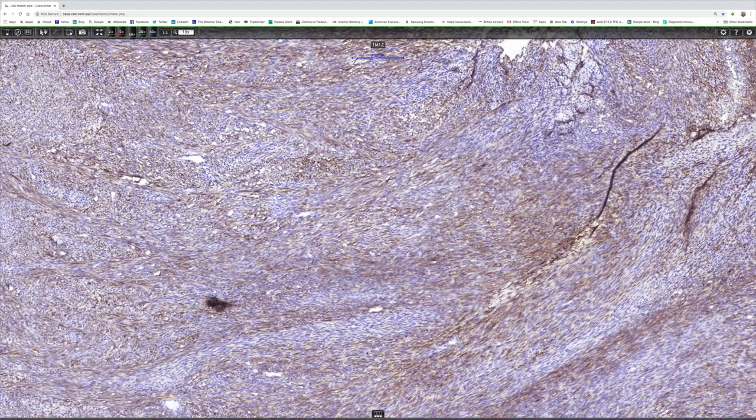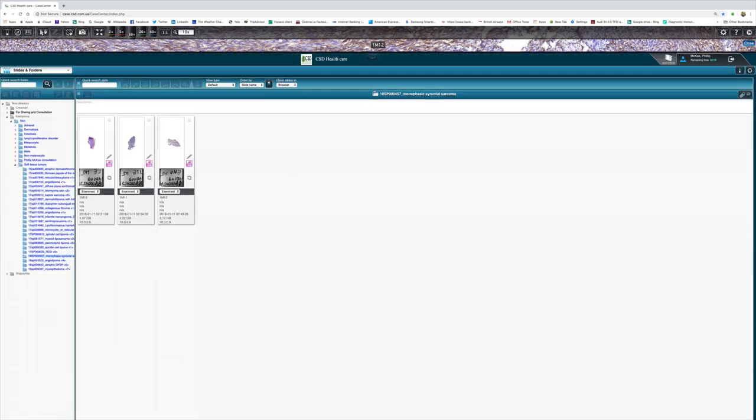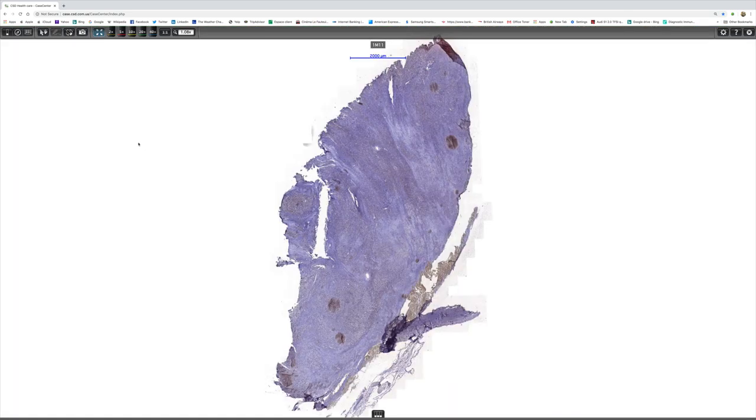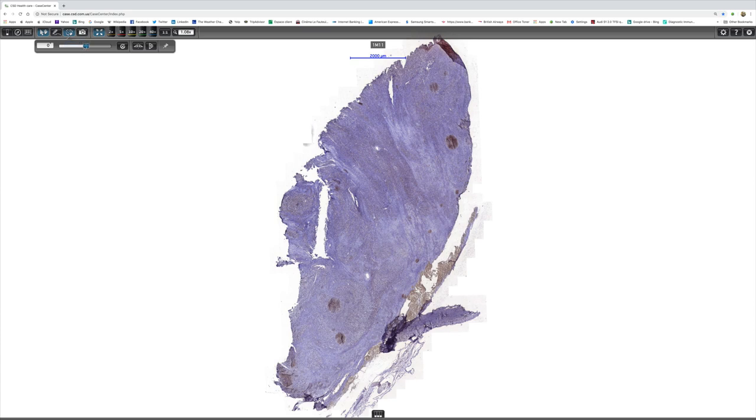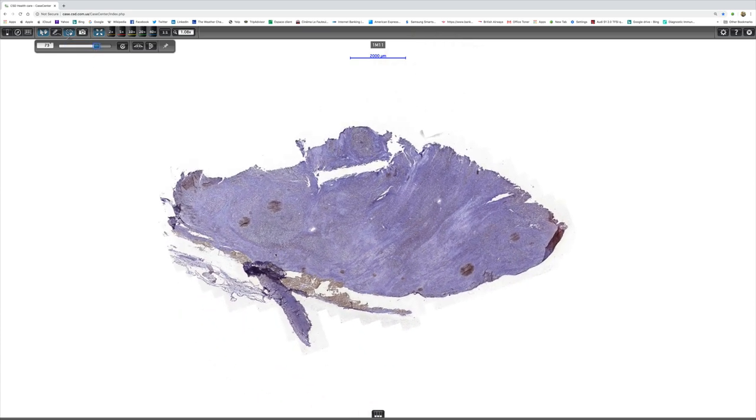Then we have TLE1 here. Now that's a nuclear stain, so it's not as obvious when you first look at it. But when we look at higher power, one can see that there's pretty strong nuclear expression.